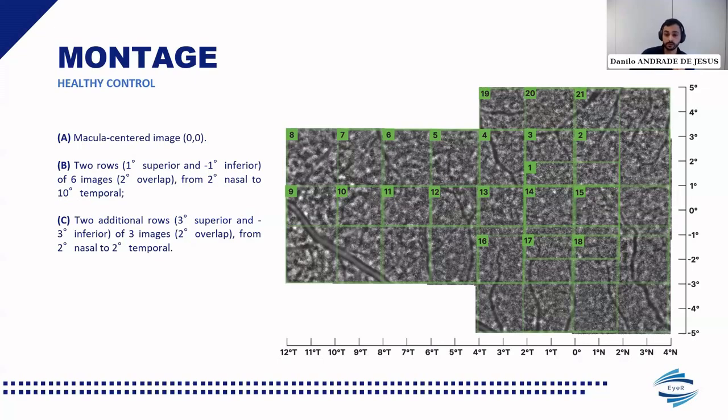So at Erasmus MC, we started by training 2 of our colleagues who have mastered the image acquisition over time. However, as you can imagine, it's not possible to always have the same people acquiring the images. And AO being a relatively new imaging technology, it has a slower learning curve when compared, for instance, with optical coherence tomography or color fundus imaging, which are imaging modalities that the colleagues in the clinic are very comfortable with. That said, this new protocol has brought several advantages to the use of AO in clinical practice.